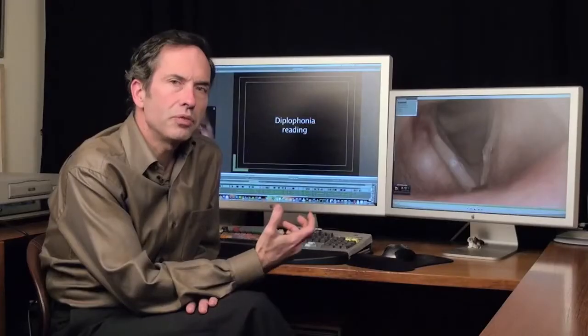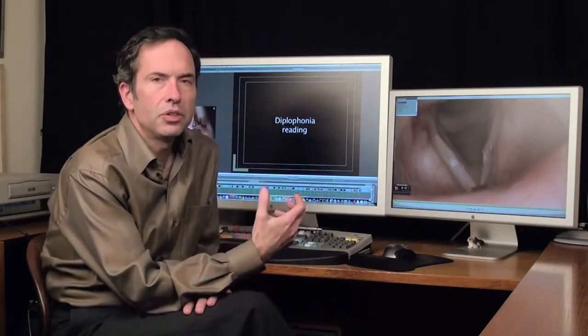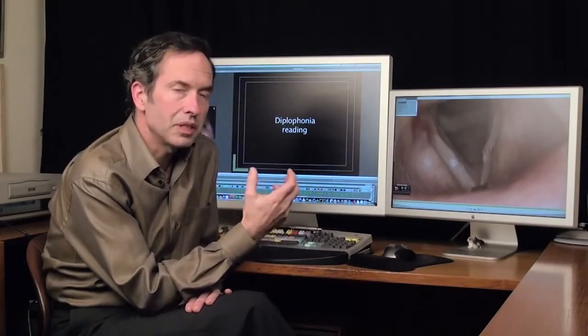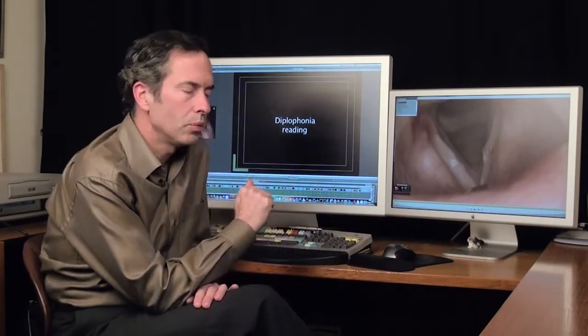We're going to hear some roughness in her voice. And that's called diplophonia or double pitch. Anytime the two vocal cords are not symmetric, and in this case, since we're suspecting she might have a bump on them, we're going to hear a roughness to her voice. So let's listen to her reading.